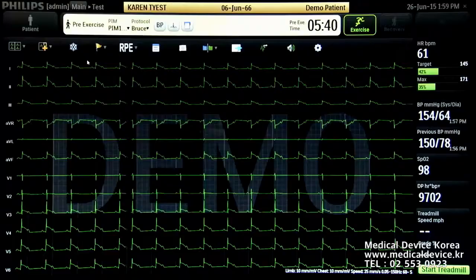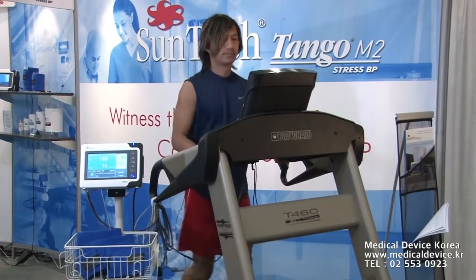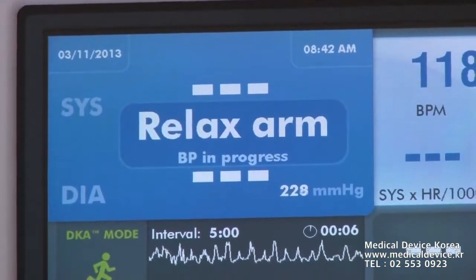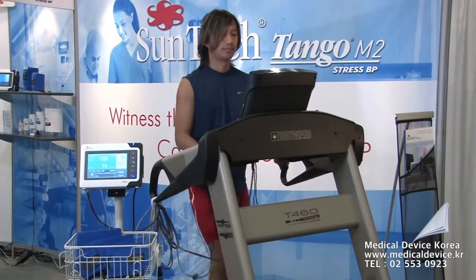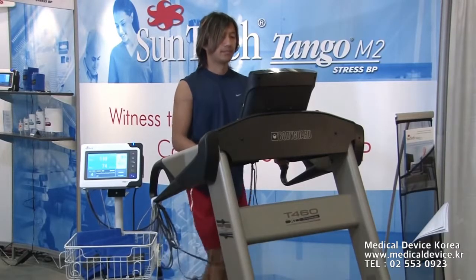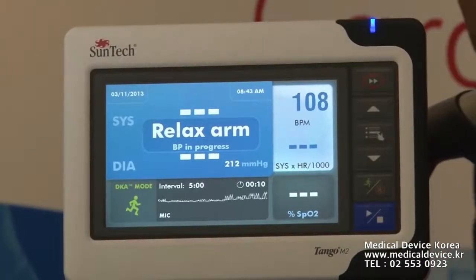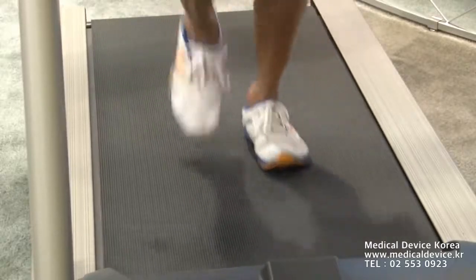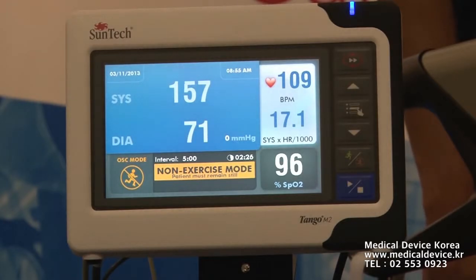The SunTech Tango M2 takes the guesswork out of blood pressure measurement with our proprietary DKA algorithm, specifically designed to overcome the noise, motion, and other physical difficulties presented during the treadmill stress test. The biggest benefit to our Tango users is that it allows you to take an automated BP reading while connecting and preparing your patient.